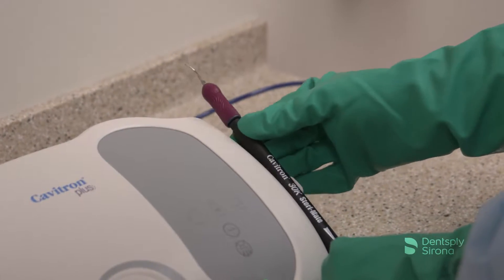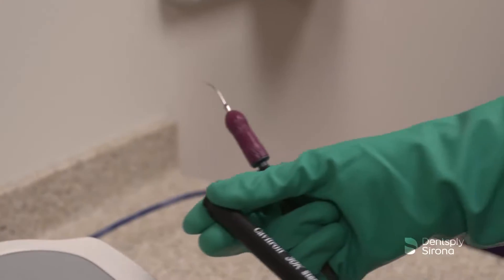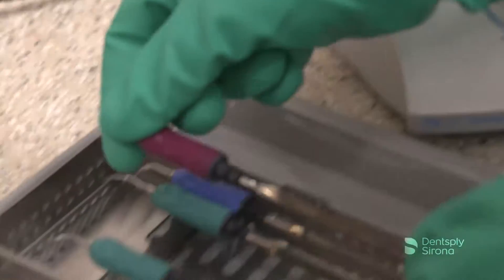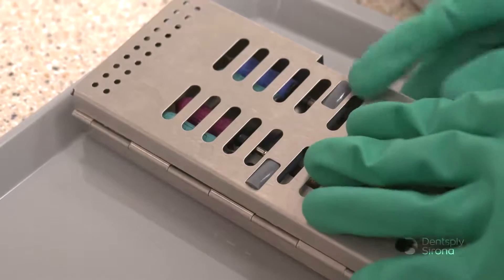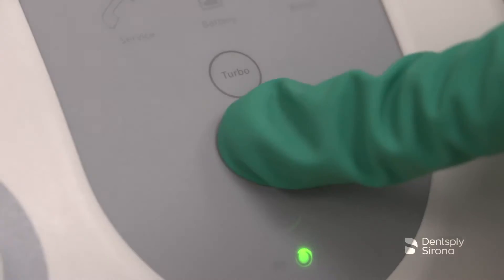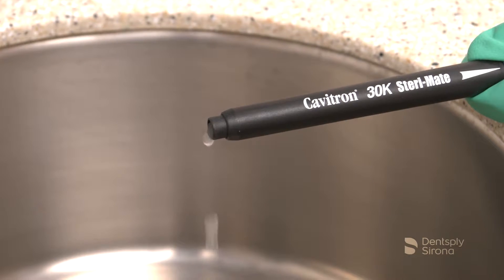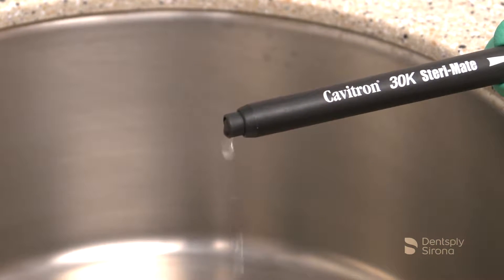To begin, remove the used Cavitron Ultrasonic Insert and secure it in a cassette or transport container. Hold the handpiece over a sink or drain and activate the purge control button. The purge function will run for two minutes. This function will flush out any stagnant water that remained in the lines overnight and releases any air bubbles that may be trapped in the handpiece.